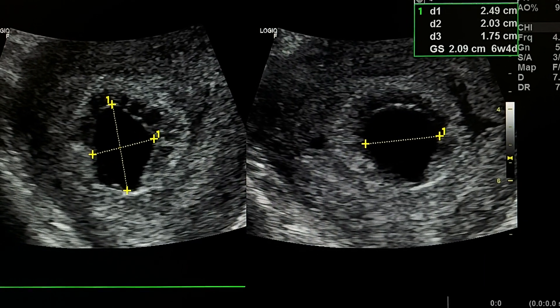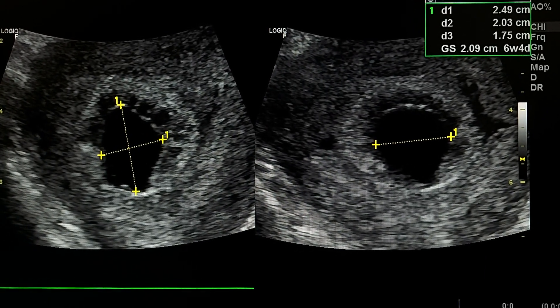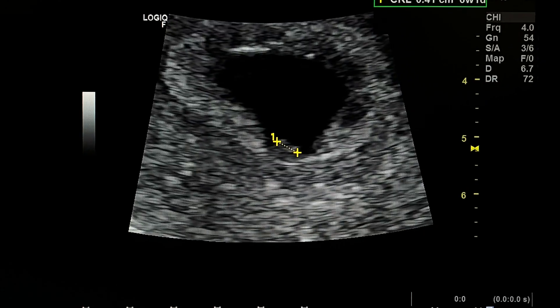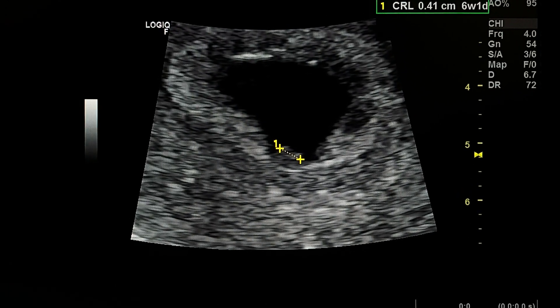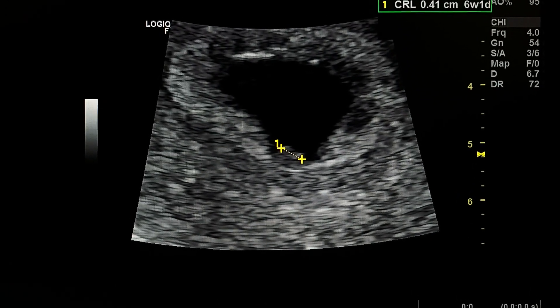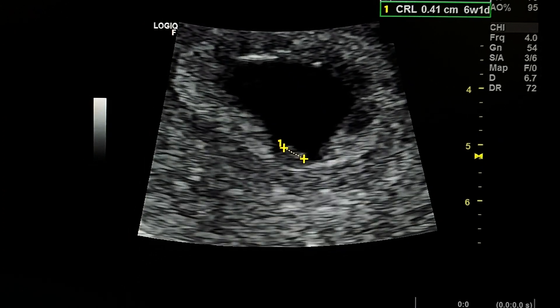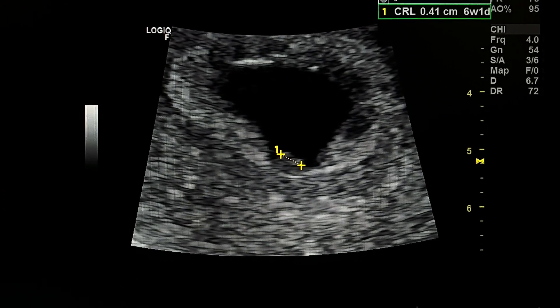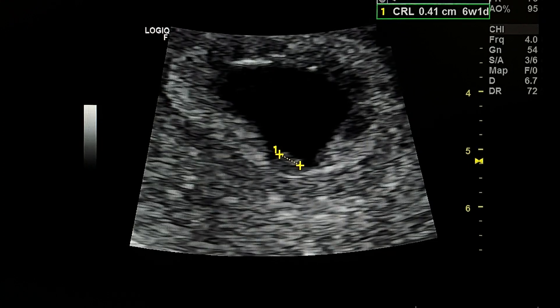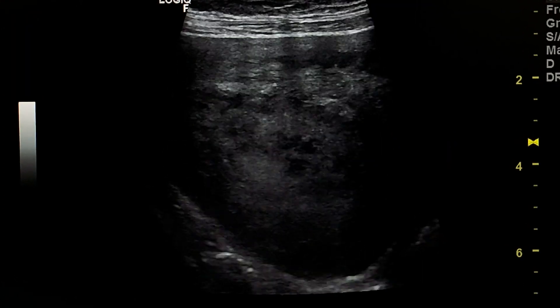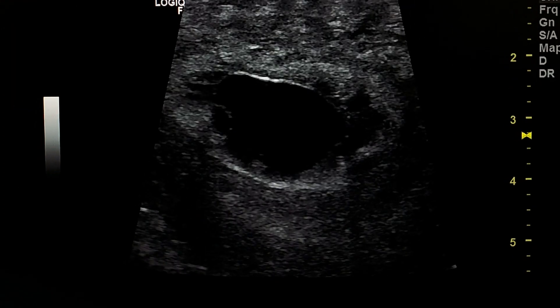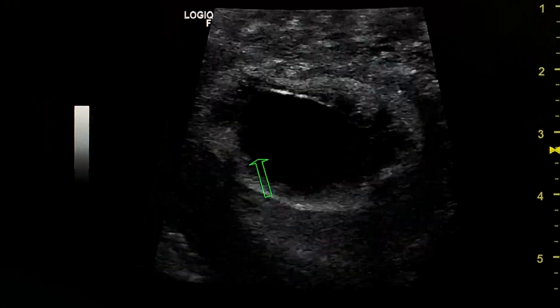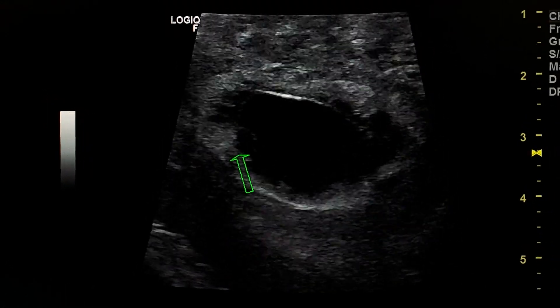By measurements, gestational age is six weeks four days. This is the fetal pole by CRL at six weeks one day. We couldn't see cardiac activity. This is the yolk sac.